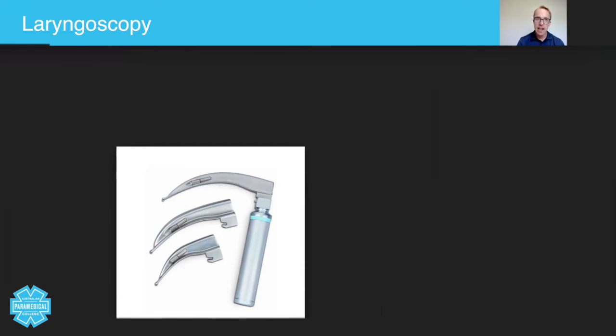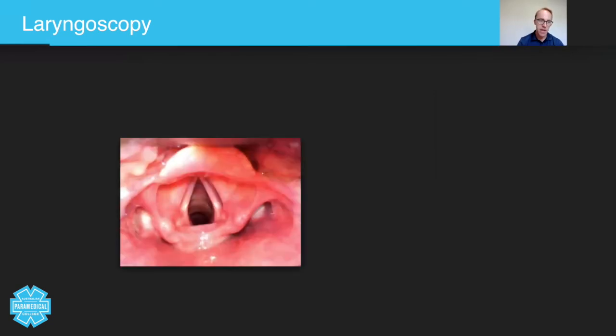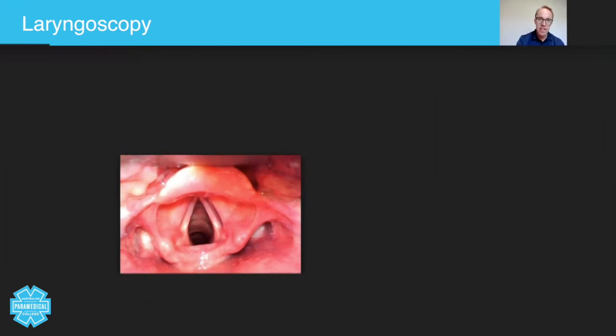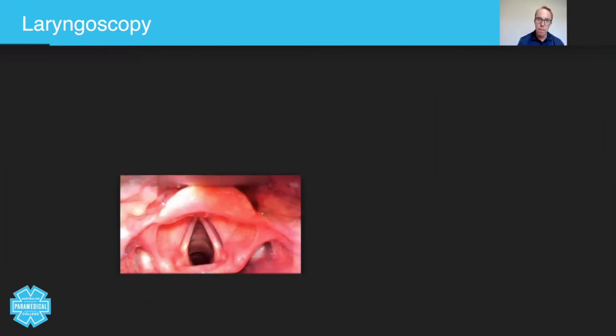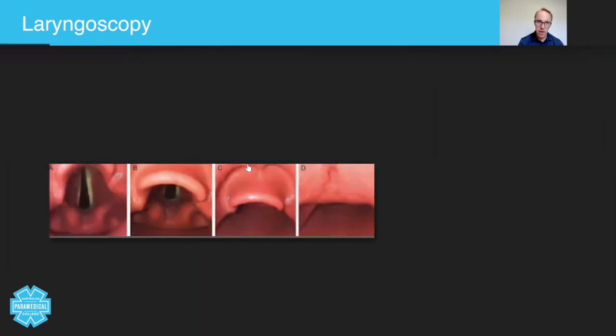And it lets you view the upper airway, which looks something like this. So the way that you do it is you open the patient's airway and you place the laryngoscope blade into what's called the vallecula space. So this is the vallecula space here. This is the epiglottis. And the blade goes into the vallecula space here.